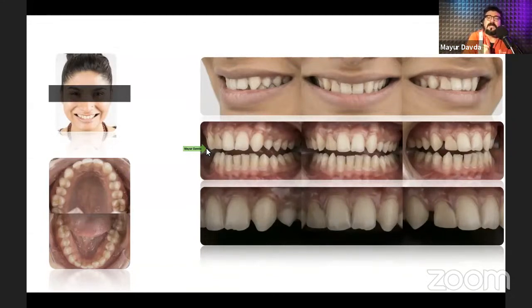So what I'm basically trying to say is try to keep favorites. For example, this shot has my favorite cheek retractor, which is called a pair of C-shaped cheek retractors. But again, I cannot use them for these pictures. So these pictures, there are a different set of intraoral accessories for. So for anterior aesthetic cases, you want something called two sectional cheek retractors and one occlusal contraster.